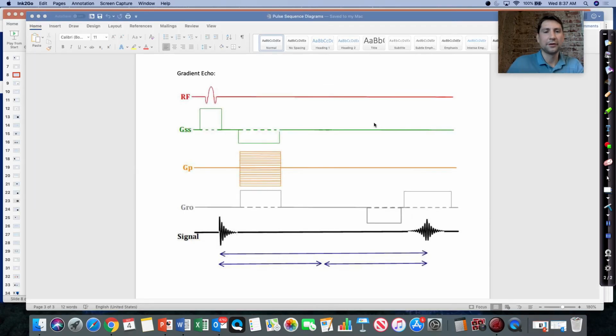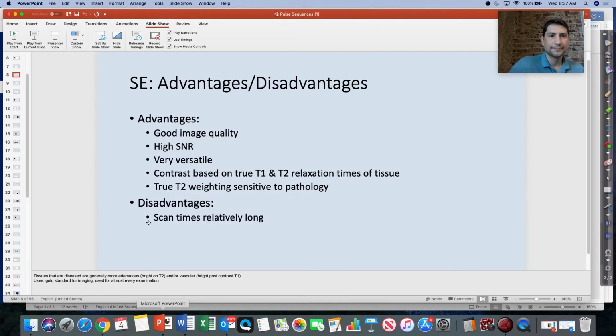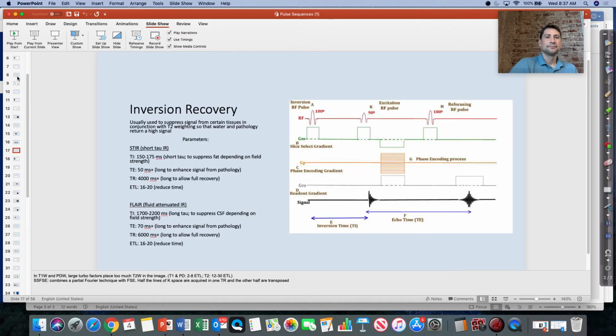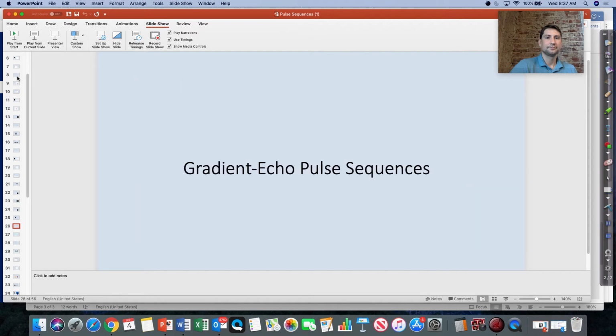All right, so let's go back to our presentation now. And let's start with our gradient echo pulse sequences.